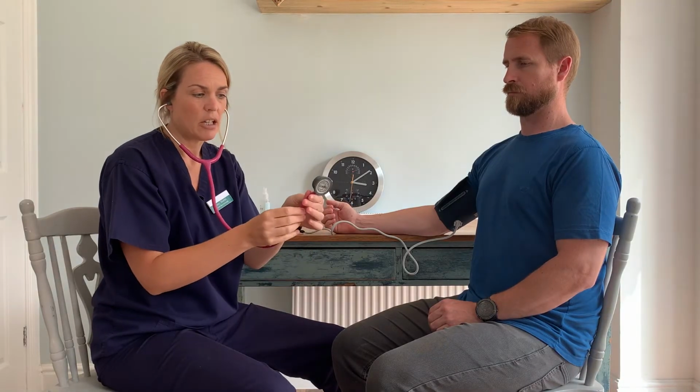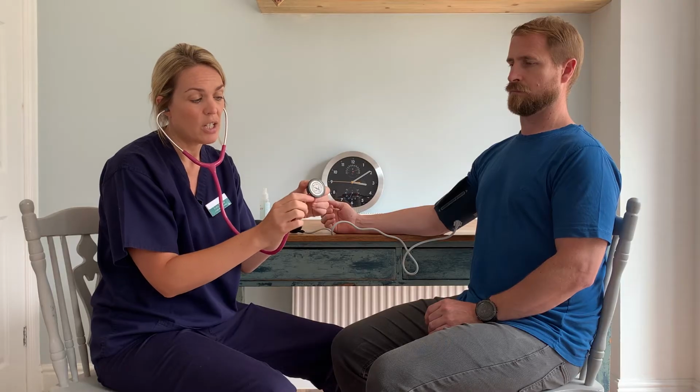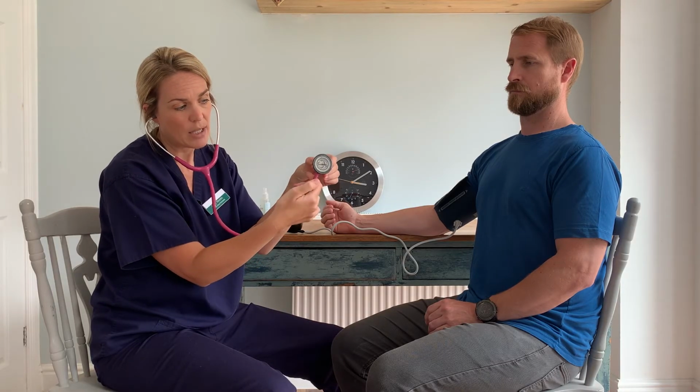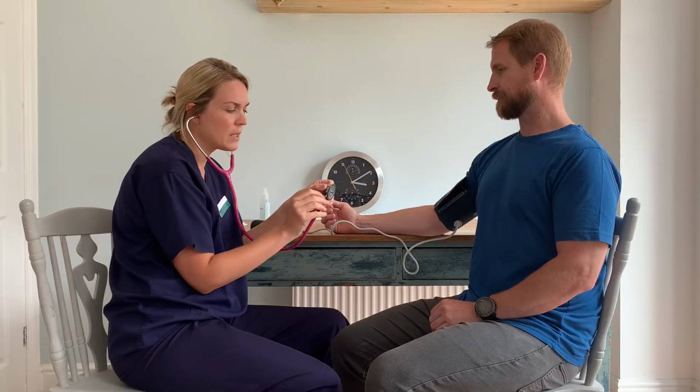At the end of the stethoscope, you've got a diaphragm and a bell. The bell is the smaller part, the diaphragm is the larger part at the end of the stethoscope. If the earpieces are pointing the right way and you tap the diaphragm, you can hear quite a loud noise. If you're still unable to hear anything, on some stethoscopes you're able to turn them around just at the bottom here. So if it's still quiet, it's worth seeing if your stethoscope is one that turns around at the bottom. Not all do, but it's worth bearing in mind.